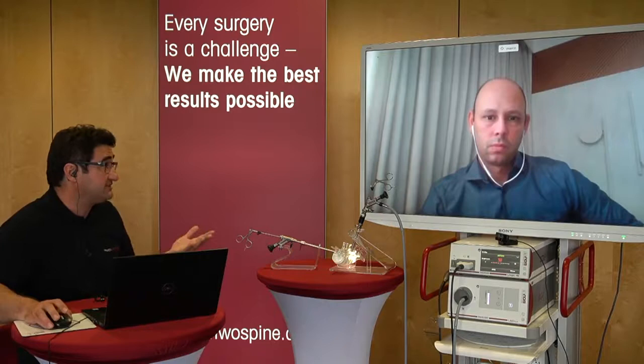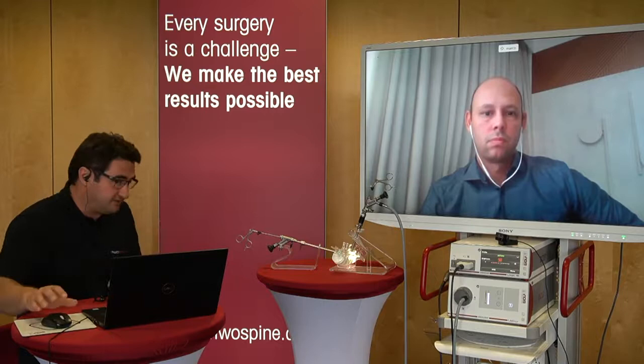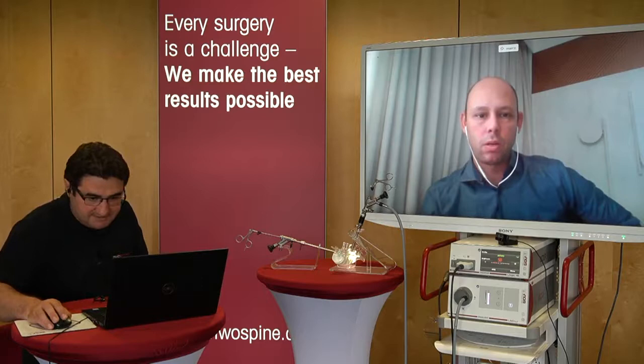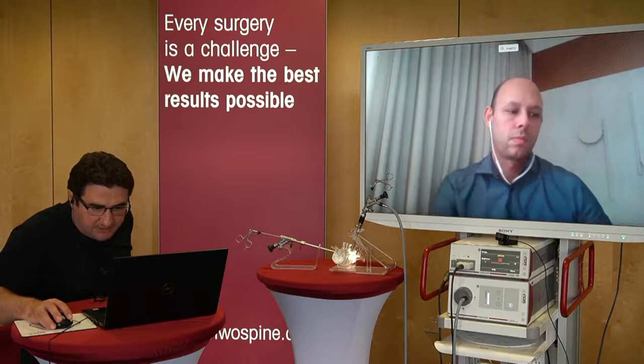Perfect. For the central herniations, there might be an option, anterior cervical discectomy, the conventional one, the ACDF. Is this question about the cervical or the lumbar spine? No, cervical. Yes, because Dr. Facundo asked about the cervical posterior approach. Okay. Is the ACDF procedure obsolete in your practice after experience with the posterior endoscopic cervical spine?